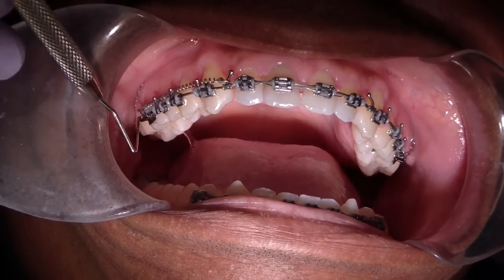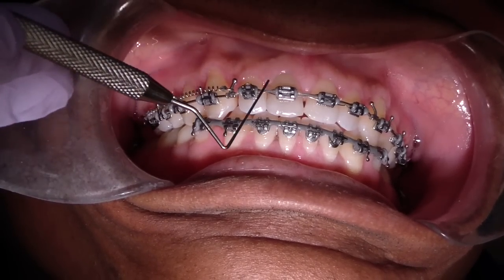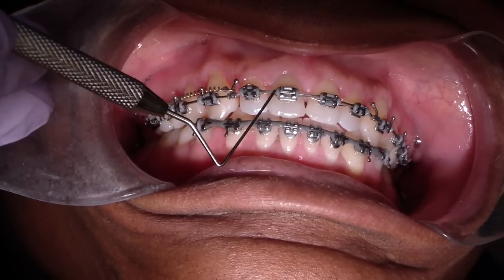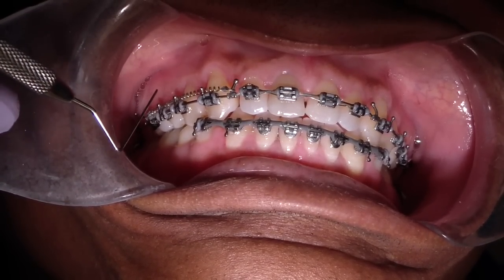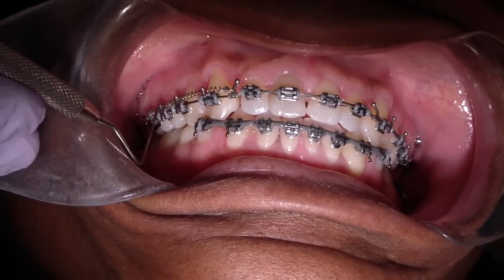We measure the amount of wire that comes out of the distal tubes on the molars. It's going a little bit more retraction on the left side one appointment, then more on the right. So I think this time we're at two millimeters on the left and 1.5 millimeters on the right.